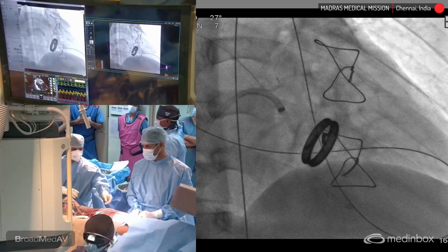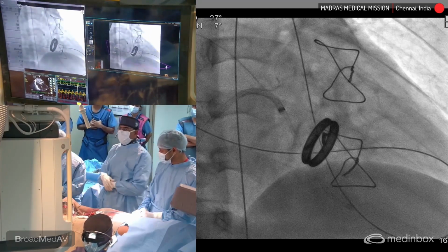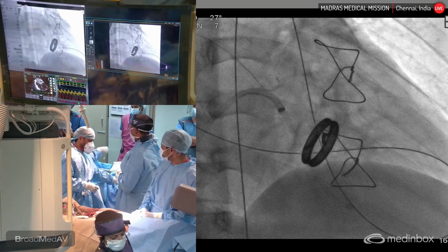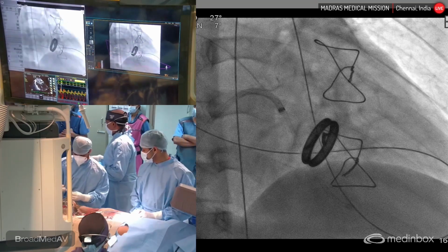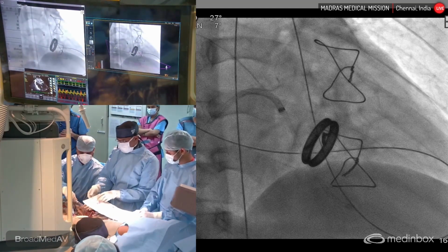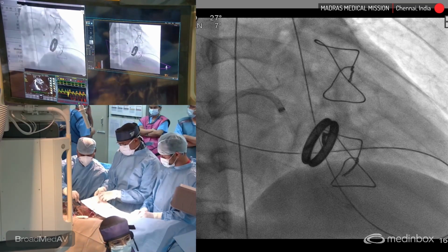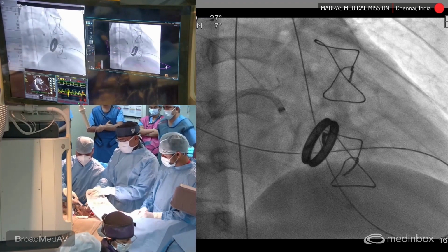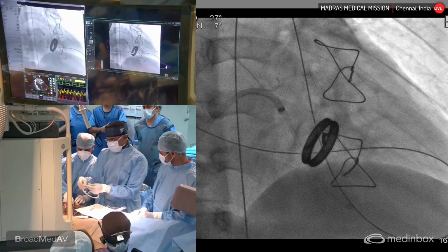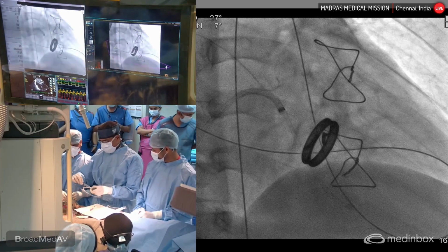Okay. While we are waiting here, let us take the Amplatzer vascular plug on the right. Have we decided, Pramod, on a 12 millimeter Amplatzer vascular plug? So a 12 millimeter Amplatzer vascular plug 2. I'll demonstrate the Amplatzer vascular plug. It is a 3-lobed device. It comes packed with its own cable. So there is a port to flush the Amplatzer vascular cable.